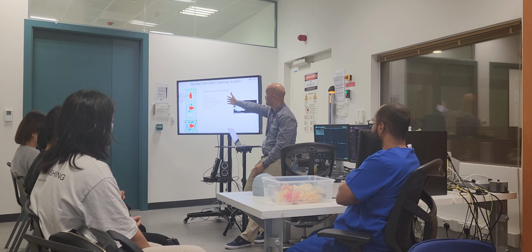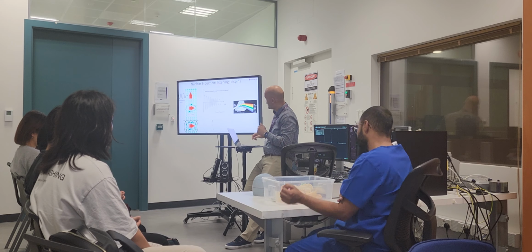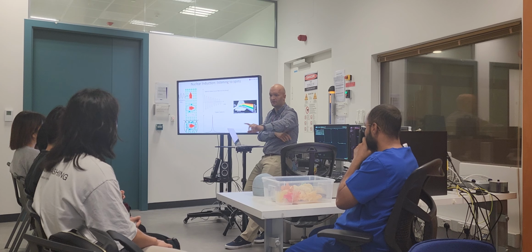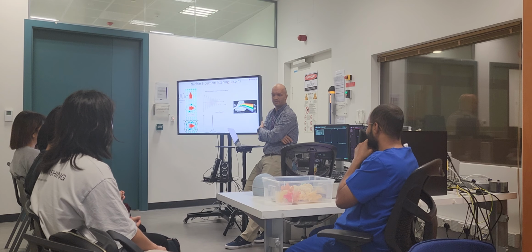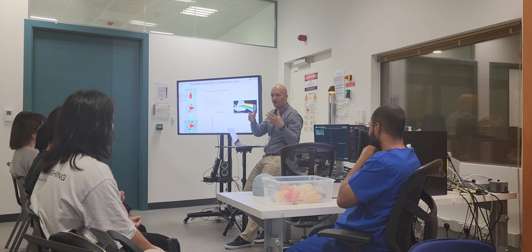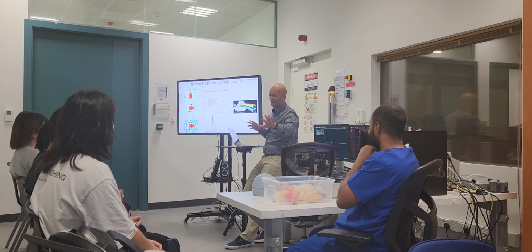Same way, I analyze the signal with a mathematical prism. We call it Fourier transform. If I Fourier transform that, I get a peak, right? And that's the free water peak. NMR guys don't like that peak. They usually suppress it, because they're interested in the little peaks that don't resonate at the same frequency as the free water, because they want to look at hydrogen, blah, blah, blah. I don't understand what he's doing, okay? But what I know is this is pretty boring. It's like, all right, other than the chemistry part.